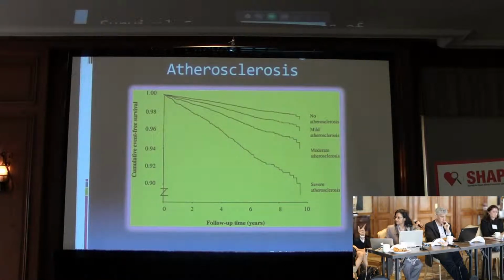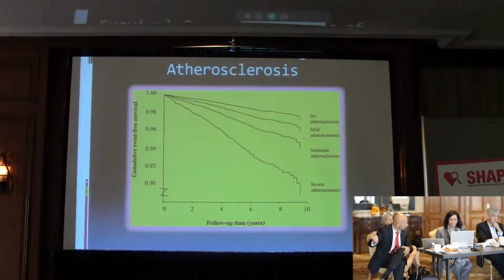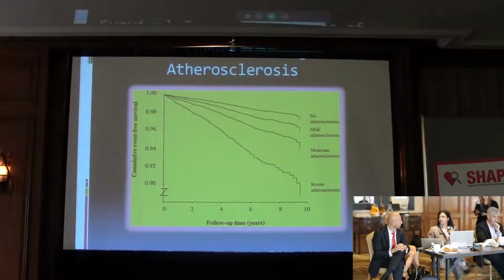So I want to break the silence here. In our problem, you said relatively easy. Is it really easy to do femoral ultrasound and be able to identify plaque and not see a lot of other stuff? I think if you're doing femoral ultrasound, you will have to confine yourself to plaque assessment and not go for IMT measurement. Even plaque, I have very limited experience.